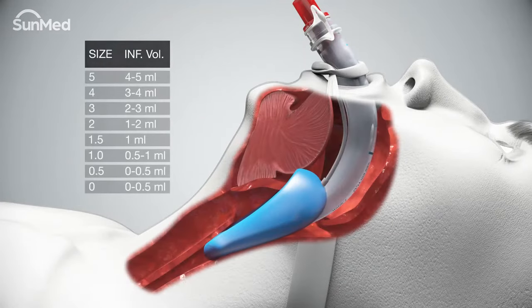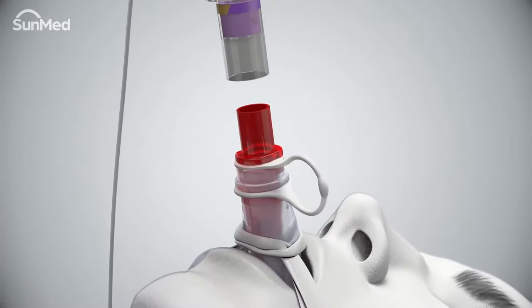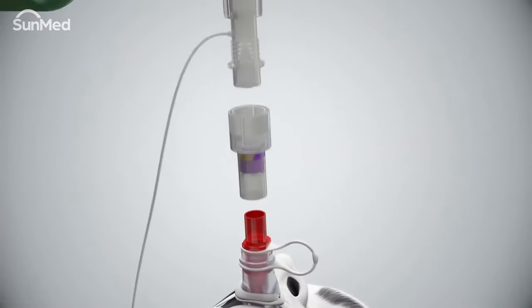Secure the air Q3 airway in place and inflate the air Q3 cuff according to the recommendations table. Do not over-inflate the cuff. Check the air Q3 connector to ensure it is fully engaged within the airway tube and attach the connector to the appropriate breathing device.